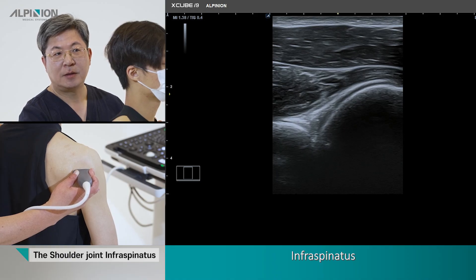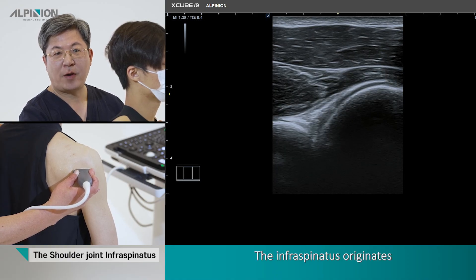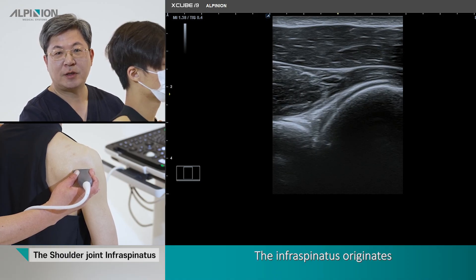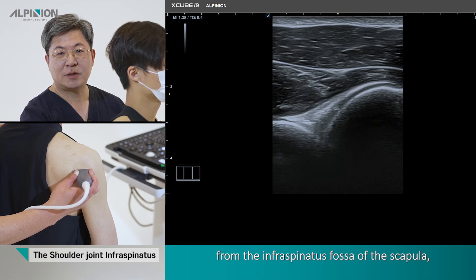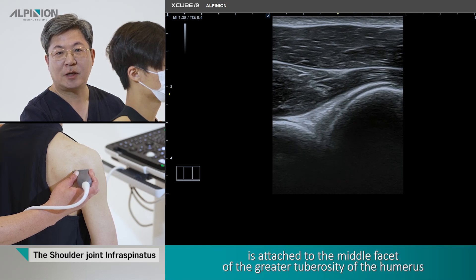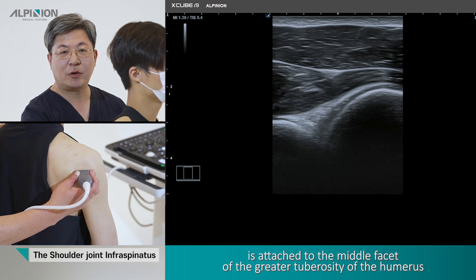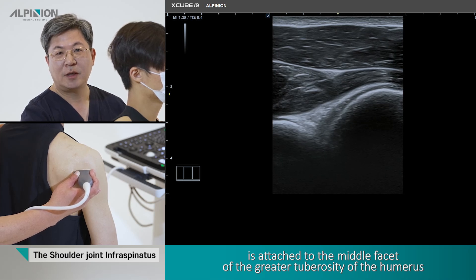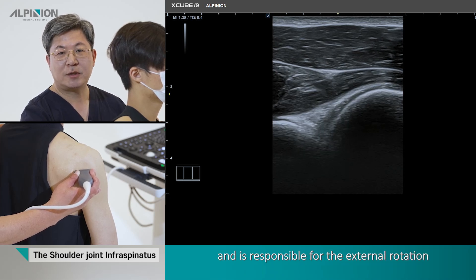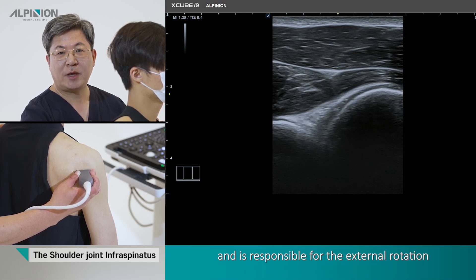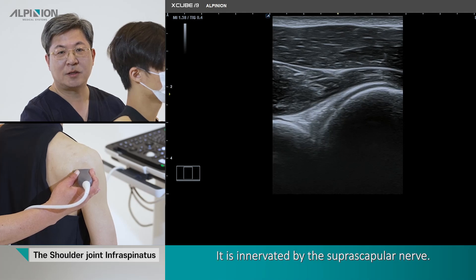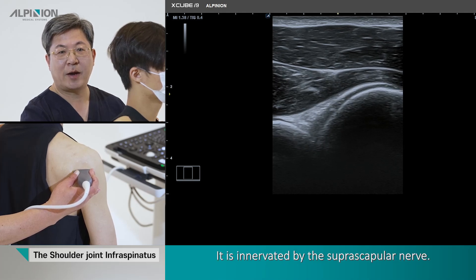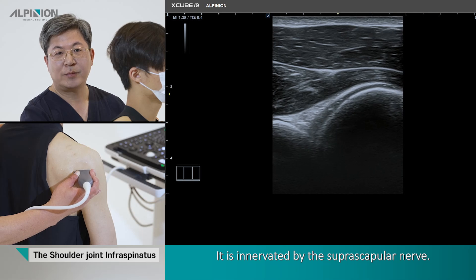Infraspinatus. The infraspinatus originates from the infraspinatus fossa of the scapula. It inserts at the middle facet of the greater tuberosity of the humerus, and it is responsible for the external rotation function of the shoulder joint. It is innervated by the suprascapular nerve.